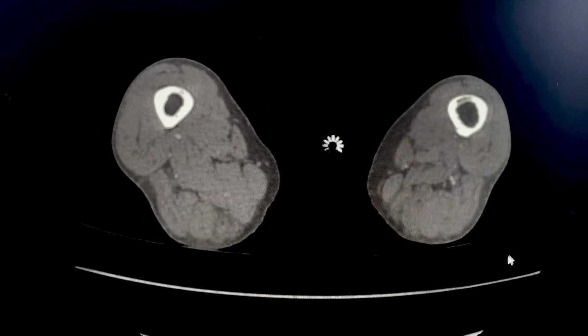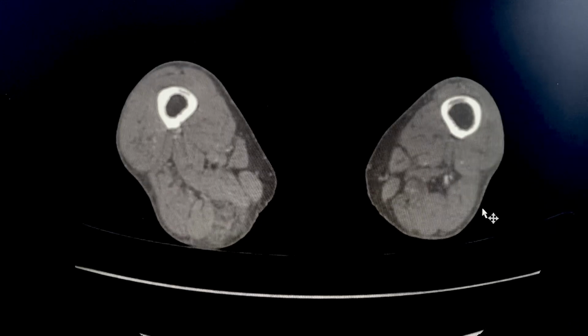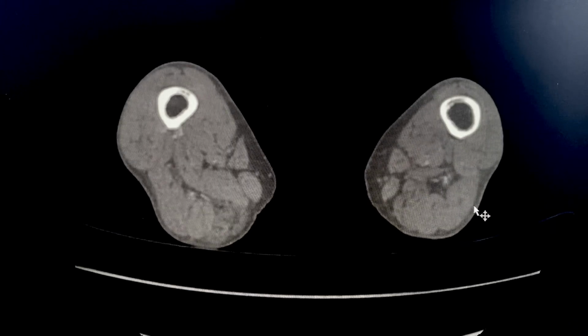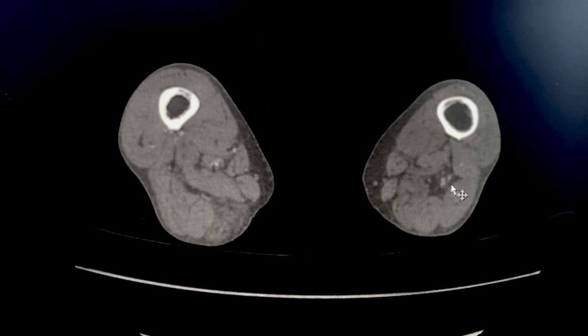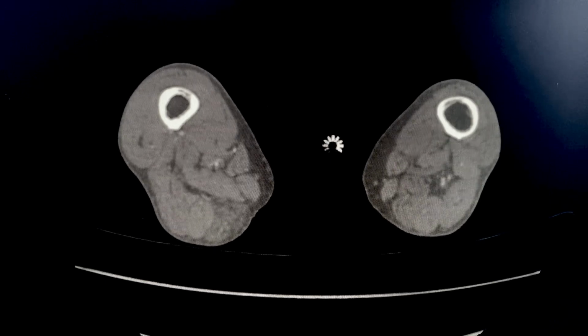Now, when we continue down to the knee, we find that even the popliteal artery is also occluded, right? You can see here that the popliteal arteries are occluded on the right as well as on the left.